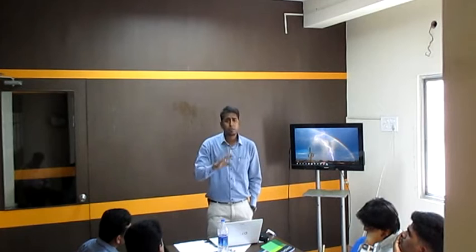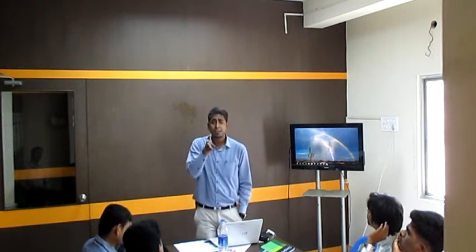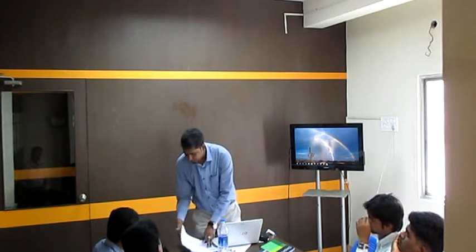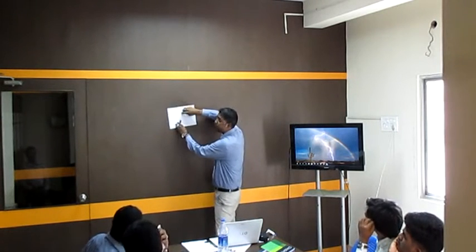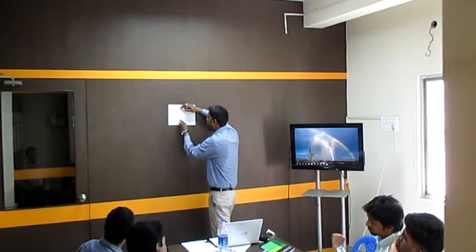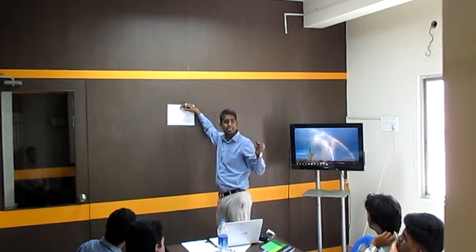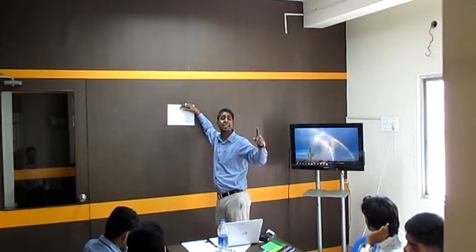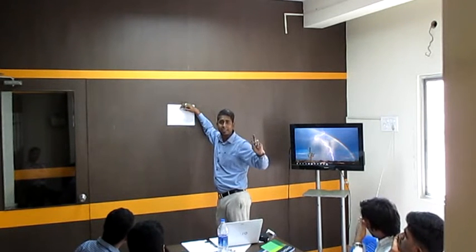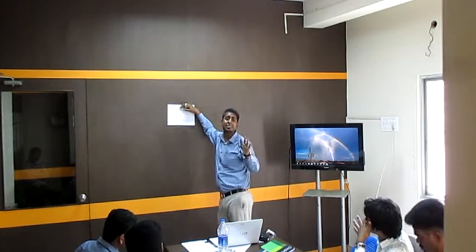But as of now, if you are not able to recall it, what is the another way by which you can identify this is an increasing handpiece or this is a decreasing or this is a same? The another way which I have told you is just to remember one thing. The first ratio will represent the input and the second one will represent the output. If the input is less and output is more, it means it is an increasing. Now, if the input is high or output is less, it means it is a decreasing.